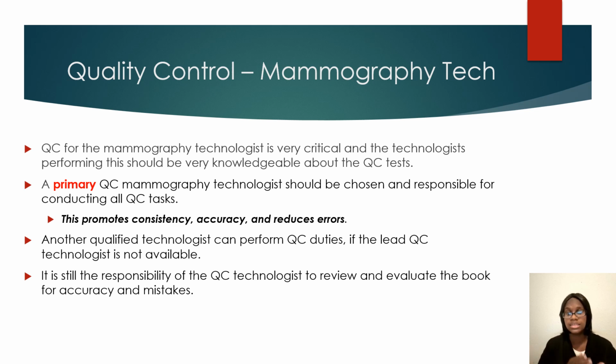So having a consistent QC tech or a designated QC tech is going to promote consistency with your QC tests, with your books, accuracy, and reduces errors. Whenever you have a lead QC tech, you know what you're writing, you know how your numbers are supposed to look. So it is the responsibility of the QC tech to review these books and check to make sure that they are not having any type of mistakes or errors in the book. If so, you have to find who is making those errors and get them to correct.